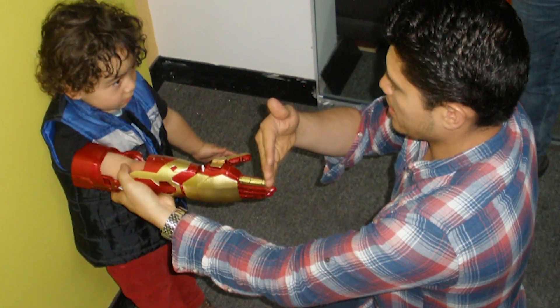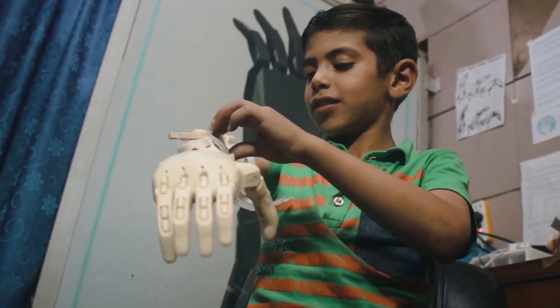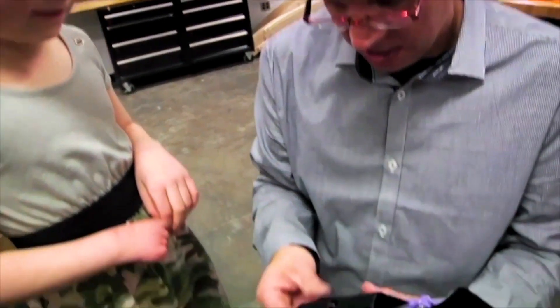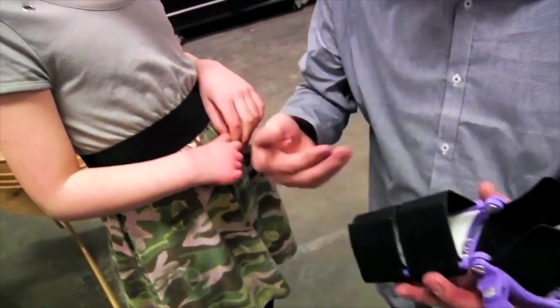In other parts of the world where the superhero hand is not the thing, an inexpensive, functional device that can go out and get dirty or get wet turns out to be a really useful social tool.